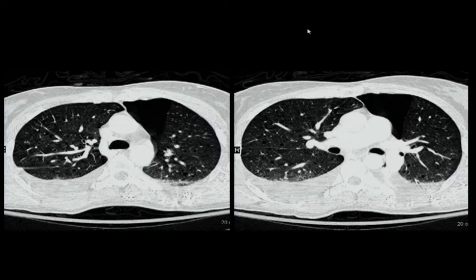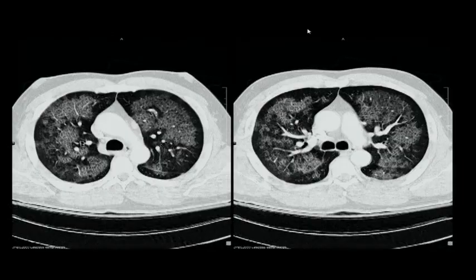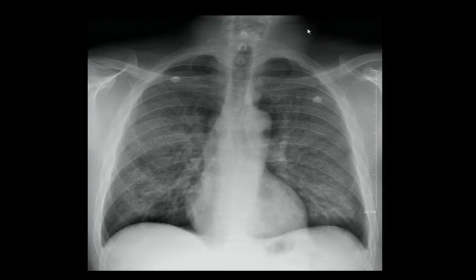So, was it looking like cotton wool appearance? Because that's why I didn't say alveolar. Yeah, it wasn't looking like cotton wool appearance. Cotton wool appearance is more when it is patchy consolidation. Whenever you see cotton wool appearance on X-ray, on CT it will turn out to be nodular consolidation, patchy consolidation. When you see bat wing or diffuse ground glass on X-ray, it turns out to be ground glass on CT. Okay? And this could have been a pulmonary edema also.